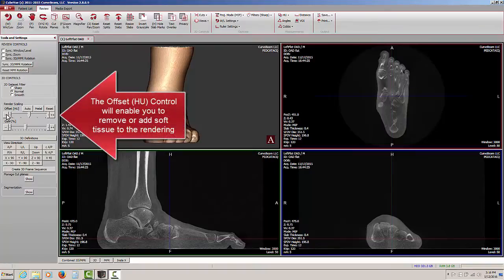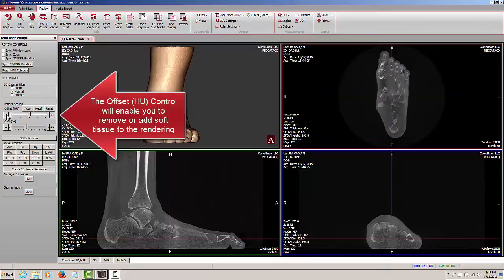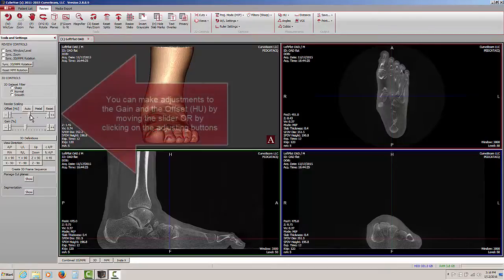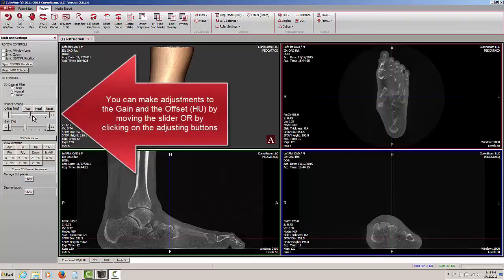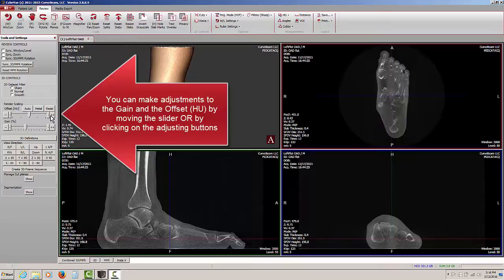The offset control, which is probably used more frequently, will enable you to remove the soft tissue and show just the hard tissue based on adjustments of the sliding scale or using the minus or plus buttons.